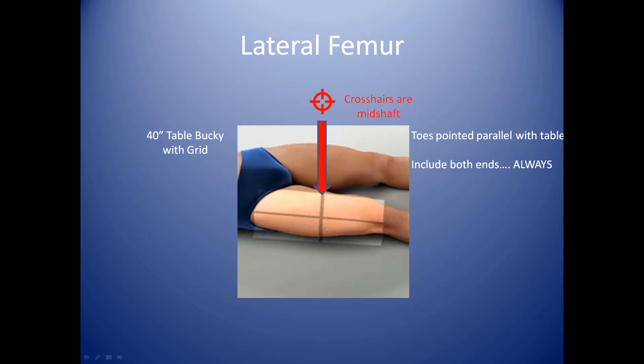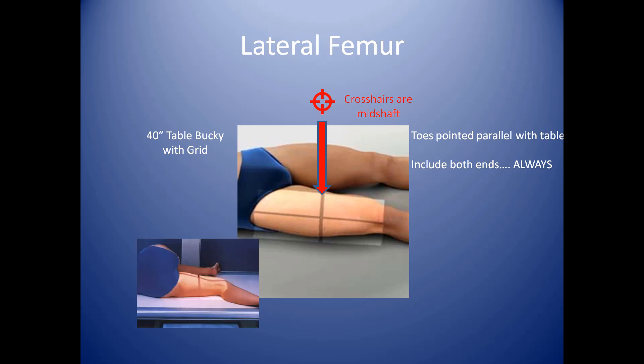Now for the lateral femur. Again, we're working with the table bucky locked in place at 40 inches. The crosshairs are on mid-shaft on a middle-sized person — you can divide this in two. Make sure your toes are parallel with the table and your knee is parallel with the table. You can bend your knee if need be; that'll probably make it easier to get a lateral image of the femur. Make sure you always include both ends on the AP and the lateral — the knee joint and the hip joint. This technique allows the patient a little more comfort and allows you to more perfectly position the patient for a lateral film.